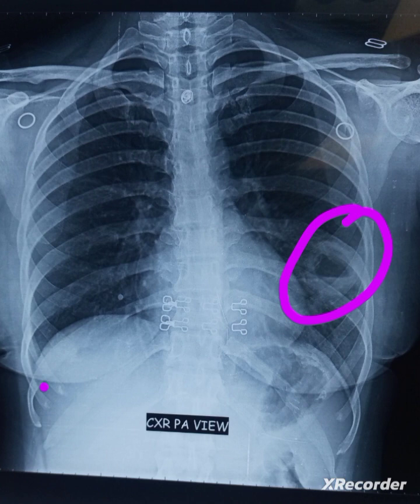What are the differential diagnoses for this? Number one is lung abscess. Number two is vasculitis such as Wegener's granulomatosis — yes, they present like that. Number three is malignancy — squamous cell carcinoma. For lung abscess, you put down all the differential diagnoses: bacterial, mycobacterial, and so on.